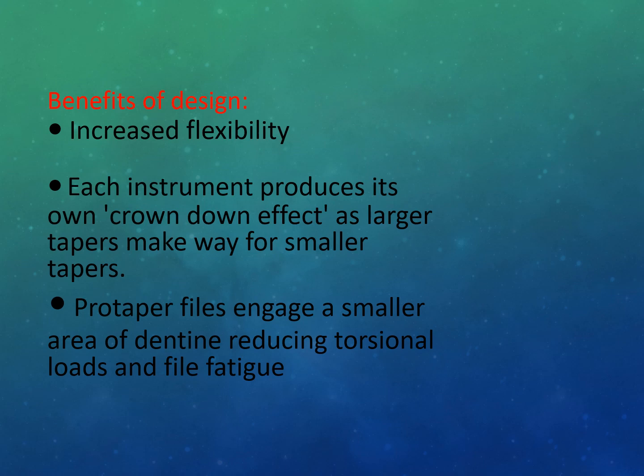Then the benefits of the design: increases flexibility. As we know, NiTi instruments have a lot of flexibility, and each instrument produces its own crown down effect, as larger tapers make way for smaller tapers. And ProTaper files engage a smaller area of dentin, reducing torsional loads and file fatigue. The same point.